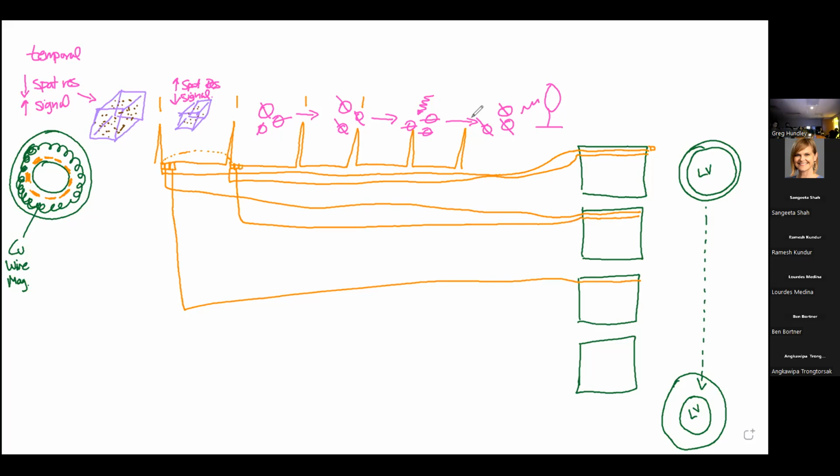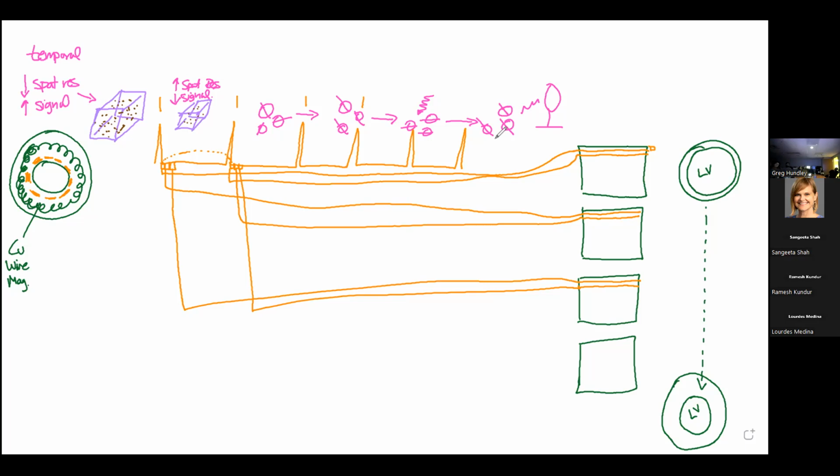And then this guy right here, over, does this line, right? And remember, when we were doing these last week, we had our total distance, which was our field of view. And then we had our matrix, right? Remember that word? And that was how many lines we were going to put in to fill up the frame. And that's how it works.